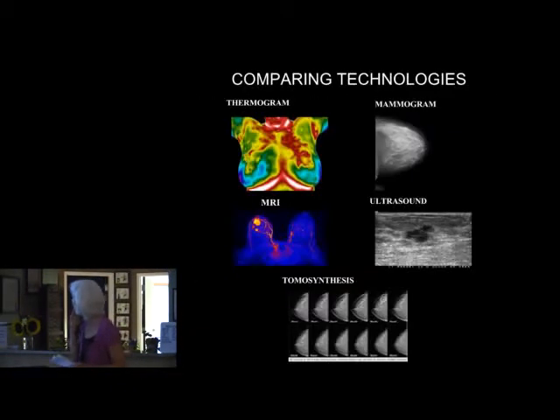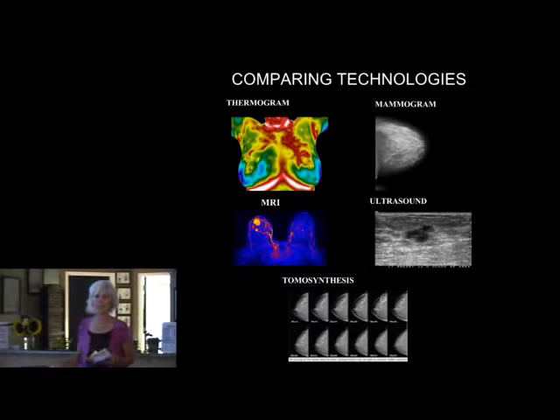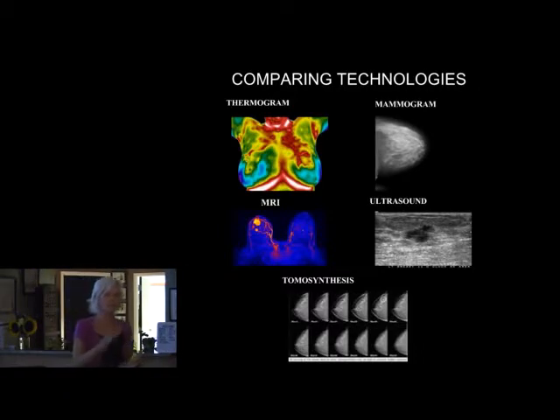How about the next one, Effie? Remember, I mentioned to you about all these images, all these screenings that you can consider, and I wanted to visually show and discuss them as well. That's the thermogram, this is the mammogram, the MRI, and the ultrasound. Ultrasound can pick up a fluid-filled cyst versus a solid cyst. And when it's solid, that's when they normally want to further investigate by doing another screening or a biopsy.